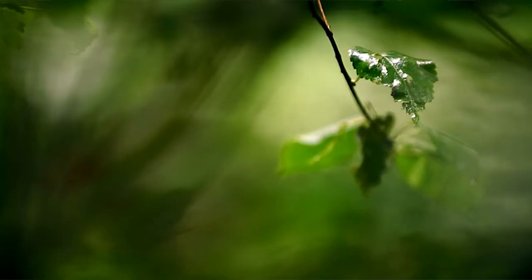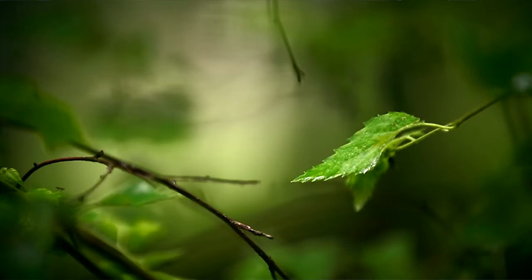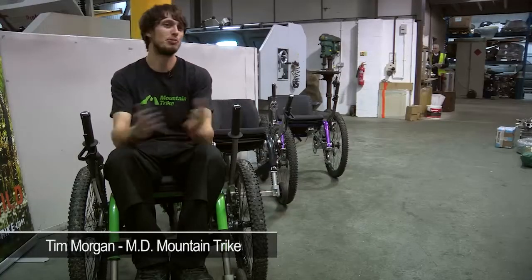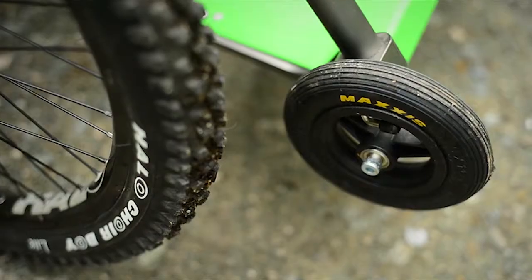At the moment, the closest thing you'll get to an off-road wheelchair is basically a standard wheelchair with knobbly tyres on, and there really didn't seem to be that kind of mountain bike equivalent wheelchair that was off-road capable but practical as well. So that was when I set about designing the mountain all-terrain wheelchair.